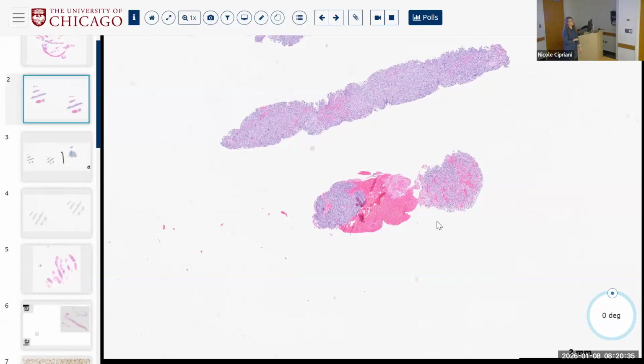In giant cell tumor of bone, which is probably similar to what's happening here, what is the chemokine or ligand receptor interaction that recruits the giant cells into the giant cell tumor of bone? Do you remember what that pairing is? RANK. It's RANK ligand. Okay, so probably there's some kind of RANK ligand thing happening here. We'll talk more about giant cell tumors of bone when we do bone, maybe next week. But it's probably something similar that's recruiting these, okay? It's a little bit young. 42 is a little bit young to have an undifferentiated sarcoma of soft tissue, right? But anything is possible. Otherwise, it doesn't morphologically have any other good differential diagnosis.